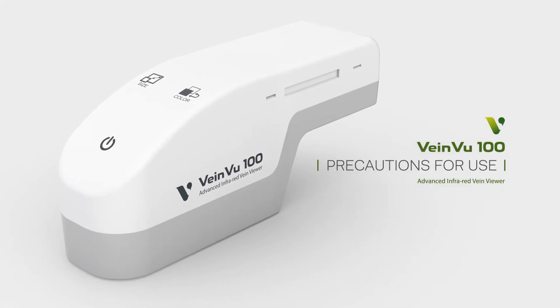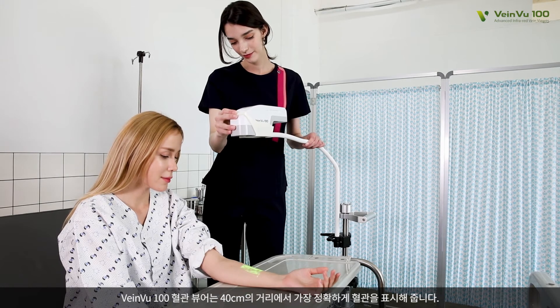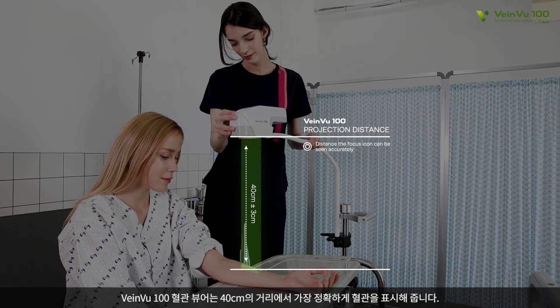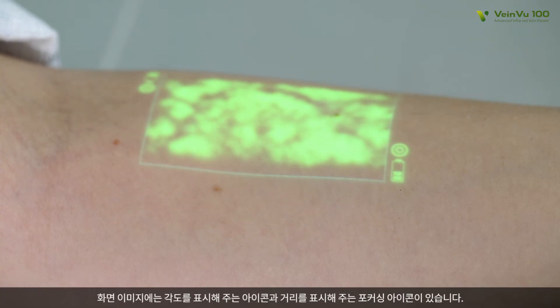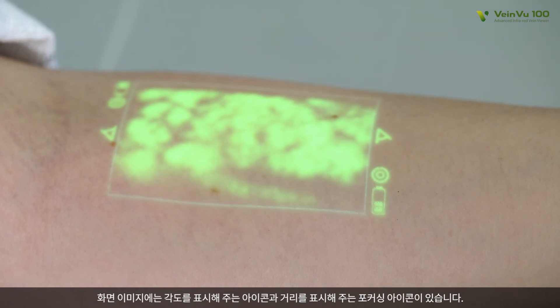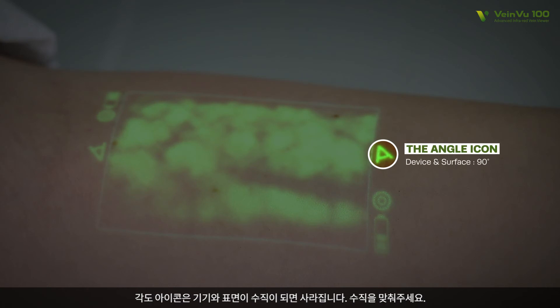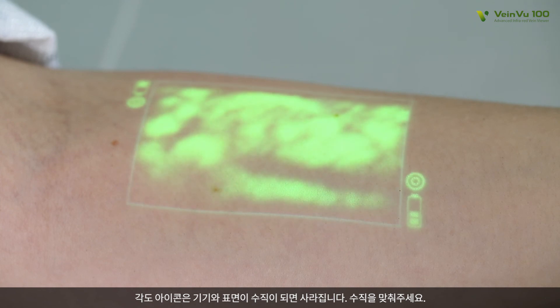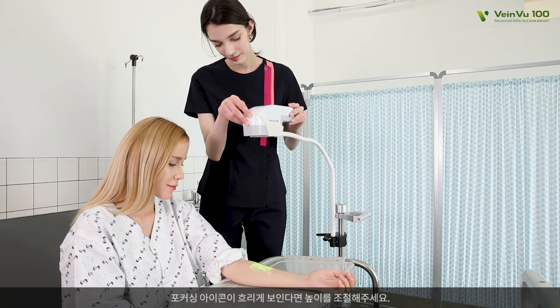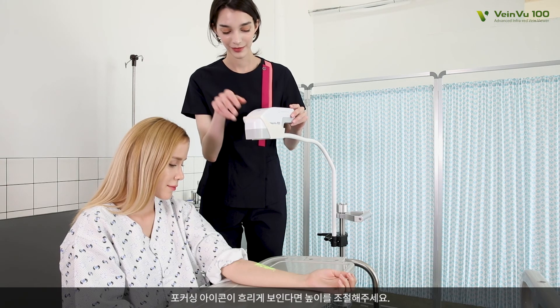Precautions for Use. VeinView 100 Transilluminator displays a vein in the most accurate way at a distance of 40 centimeters. The view image has an icon to display an angle and a focusing icon to show distance. The angle icon disappears when the device is perpendicular to the skin's surface — make them vertical. The focusing icon appears clearly at a distance of 40 centimeters. If the focusing icon looks unclear, adjust the height.